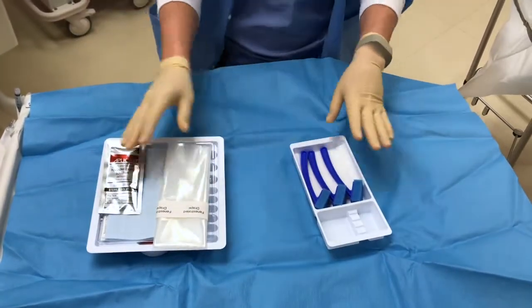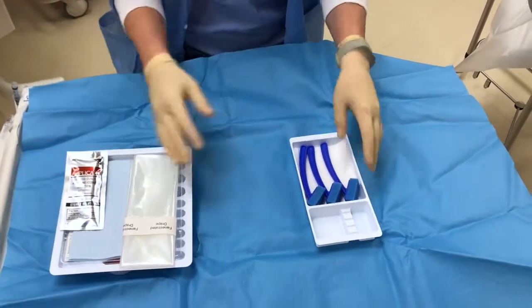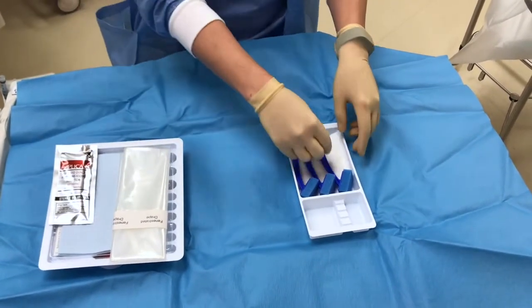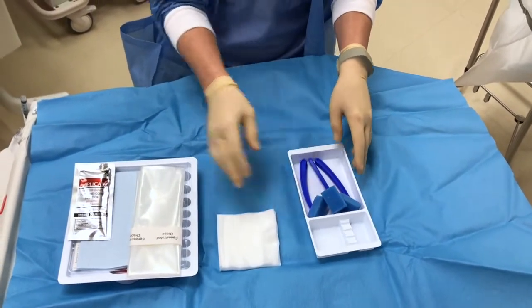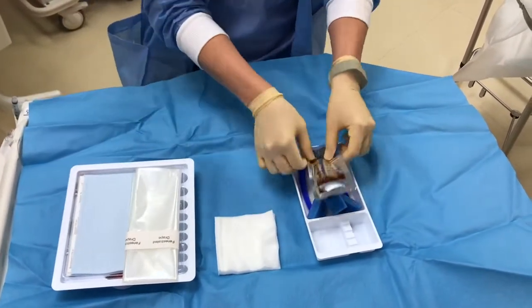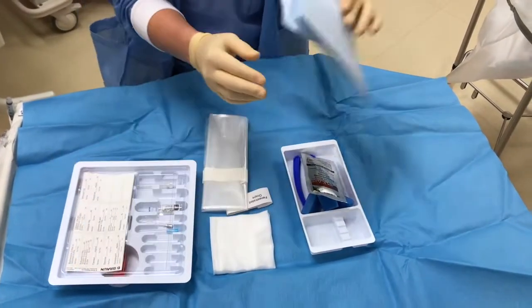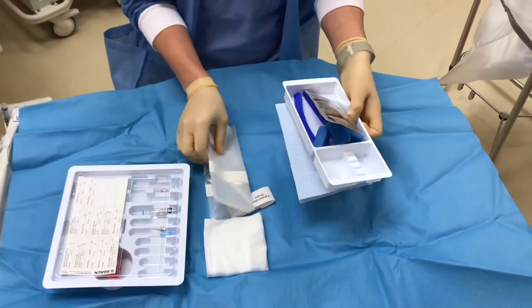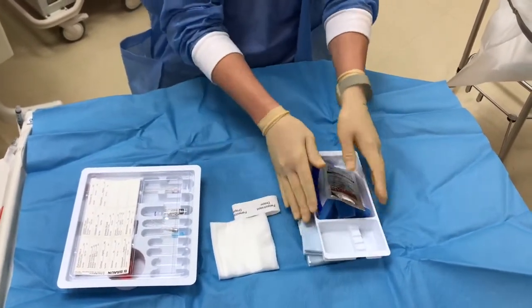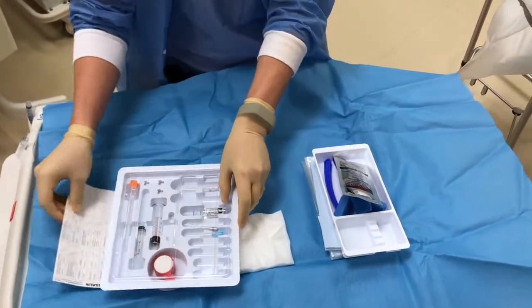However, I'll just set this up because for learning purposes it's easier to go through what your setup's going to be. Again, I like to set up in the order that I'm using my equipment. I usually take the gauze out of that tray first, and you know that your prep's going to come first. And then you'll dab the excess liquid, and then you'll don the plastic drape. So I like to put them over here in the order in which I'm going to use them. Have your labels.